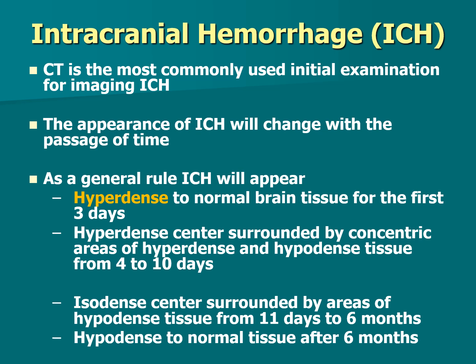Some of the things that we look for a lot in injuries are intracranial hemorrhages, ICH. And so we'll classify those as three different types of hemorrhages. CT is the most commonly used initial examination for imaging for intracranial hemorrhage because, again, we don't have to screen the patient. We can bring the patient right in, no matter where they've come from, what condition they're in, and do a CT scan. We will get a good idea of what's going on.